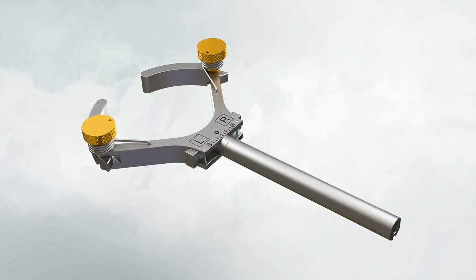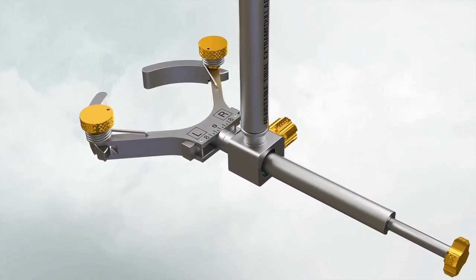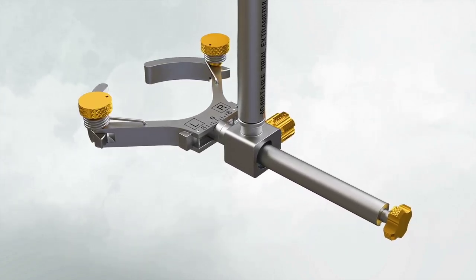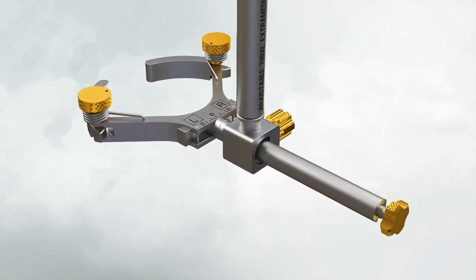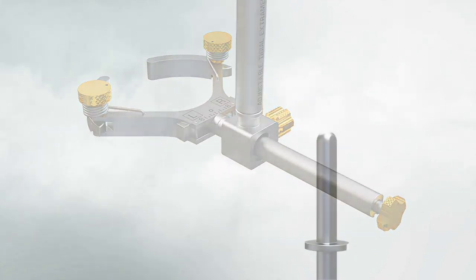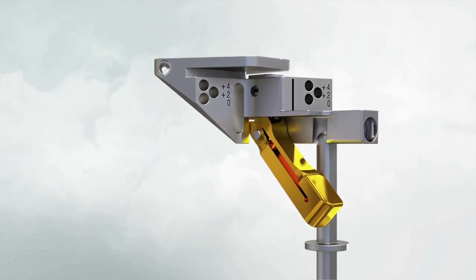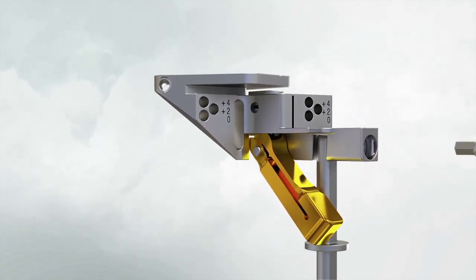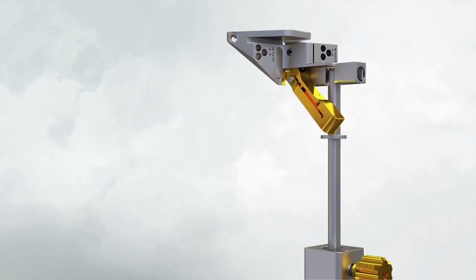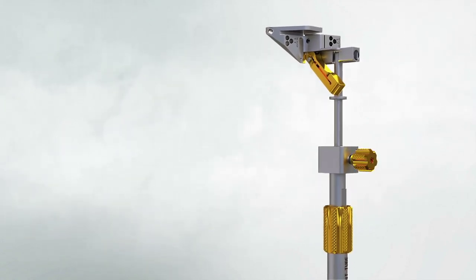Insert the ankle clamp into the distal end of the alignment tube and thread the locking pin into the ankle clamp. After the ankle clamp is moved into the proper position, lock into place with the gold knob. Choose the correct 3-degree left or right datum block. Place the appropriate left or right 3-degree tibial datum block on the non-spike fixation rod, tighten the central screw to lock the block into position, then introduce the rod into the extramedullary assembly and adjust and lock the locking screw.